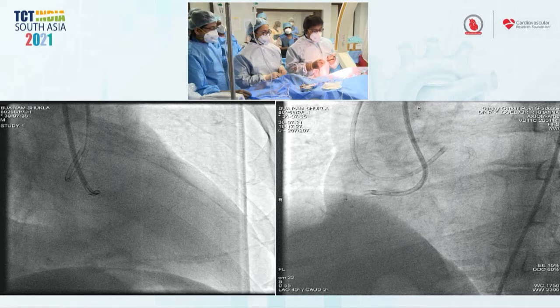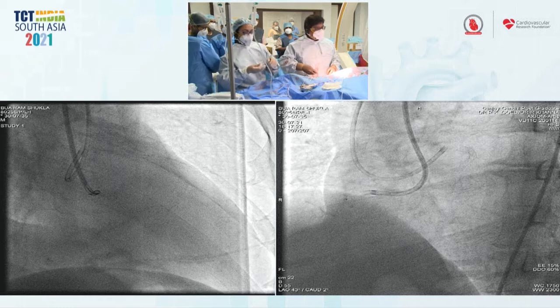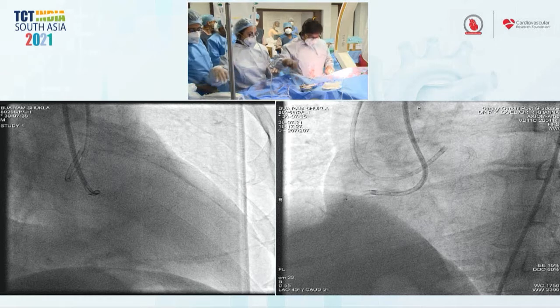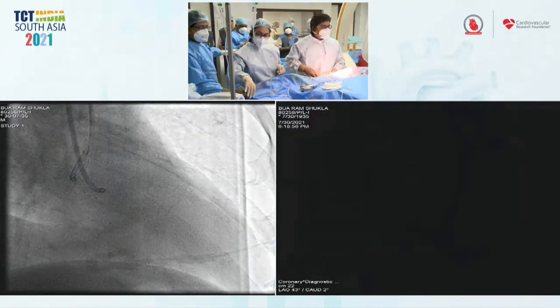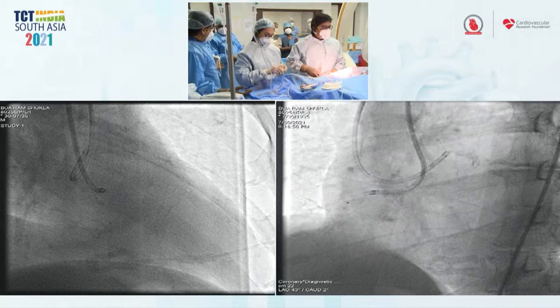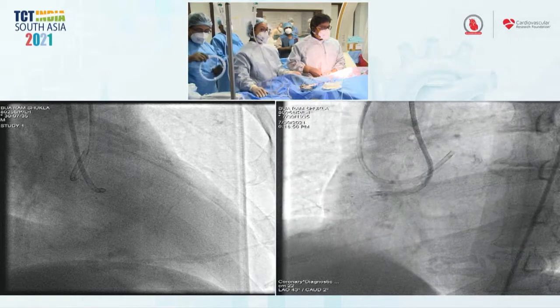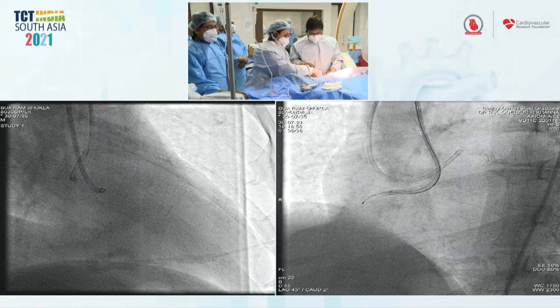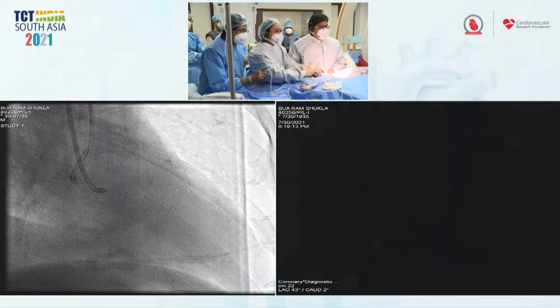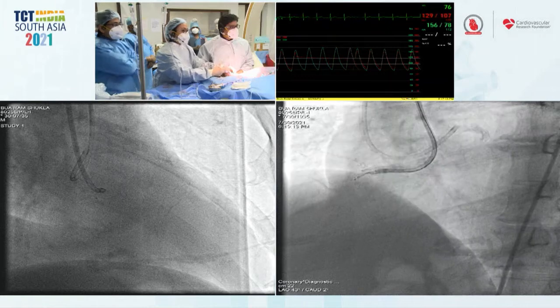Kevin, what would your initial wire and microcatheter be? Turnpike Spiral, Mongo, or Pilot 200 typically. So that's the XT wire. Dr. Mustafa, what would your microcatheter and wire be? We'll be taking a microcatheter, and Fielder XT is my first choice, and then I might try a Gaia wire. I have seen Fielder XT cross some very difficult lesions sometimes. So let us see what this does. Ganesh, what would your approach be? No, I'm an interventional radiologist. I don't think I'm qualified to answer that question.